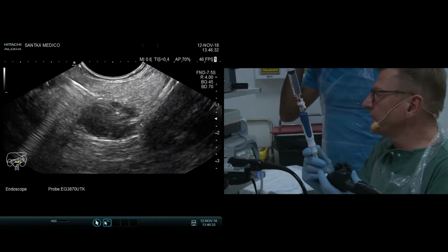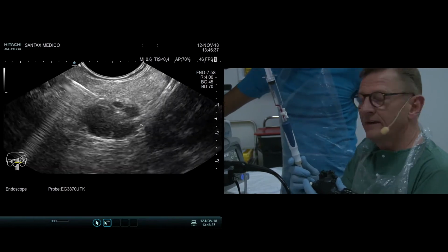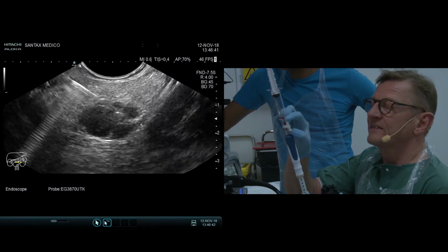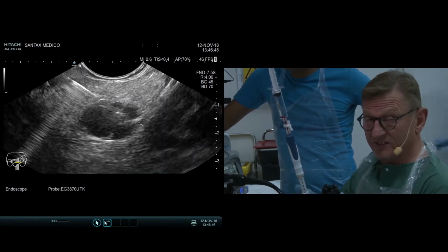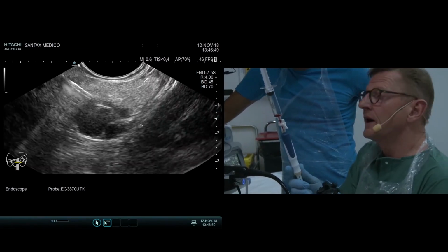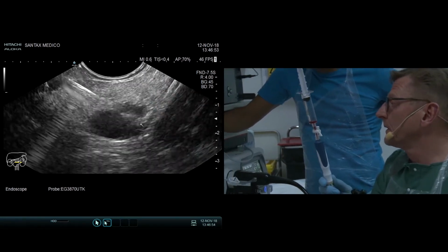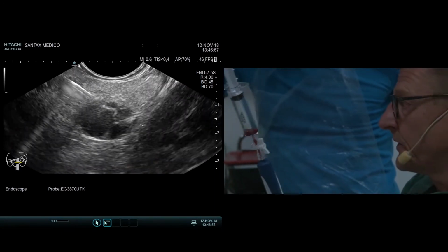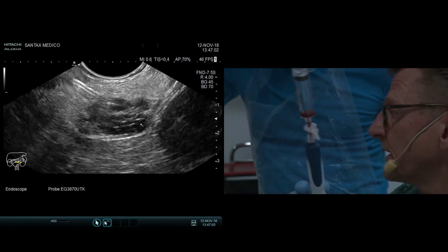It was interesting for me to hear Thomas Huckel's lecture, where he said that it's not enough to release this or to lock this, because the suction will stay on. And I fully agree. That is also what we do. It's a little bloody. Can you see that? So that might be compatible with a serous cyst adenoma, that it is a microcystic.